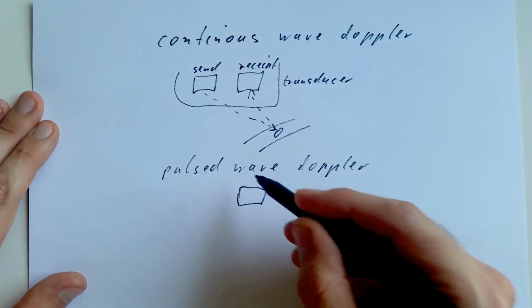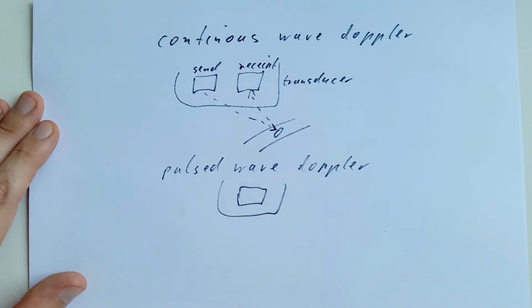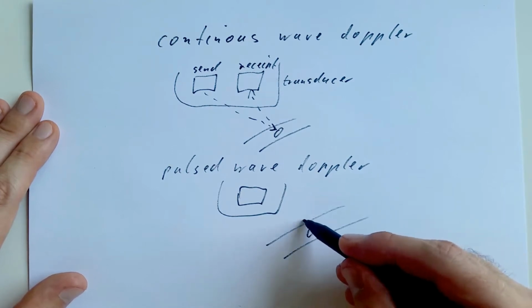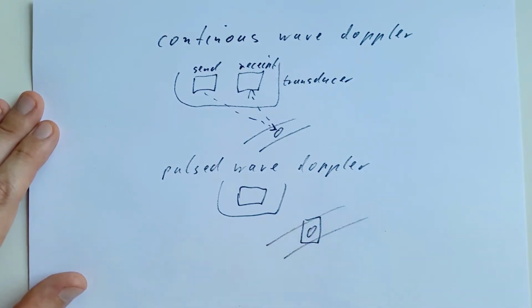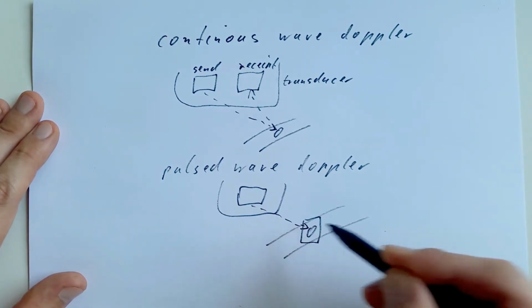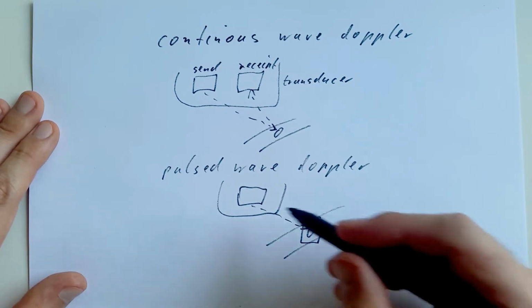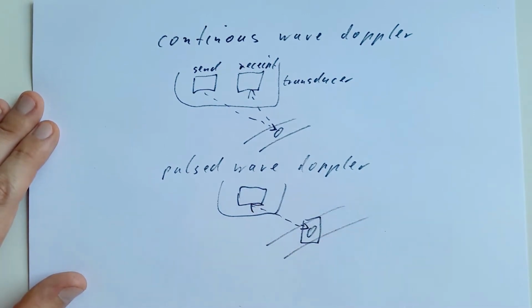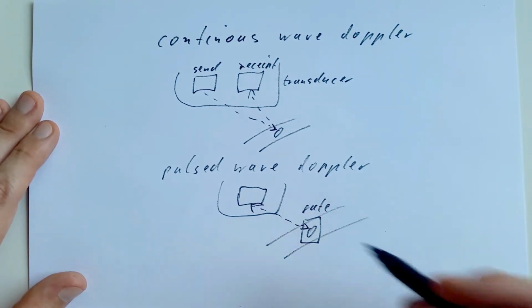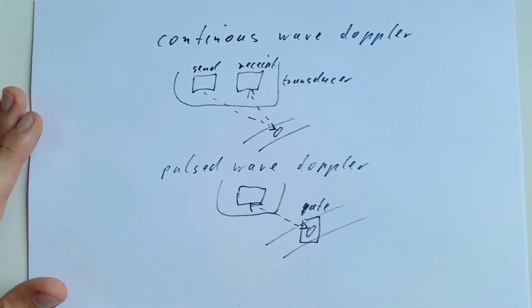The pulse wave Doppler makes classification easier. During this technique, we have just one crystal, but in addition, we have a sort of gate, which helps us to match or allocate the depth in the bloodstream and the corpuscles. This is a benefit in comparison to the explained continuous wave Doppler, but the disadvantage is the limited flow speed, okay? Anyway, if we look at the bloodstream, the gate enables us to measure and examine something at a defined point and depth.